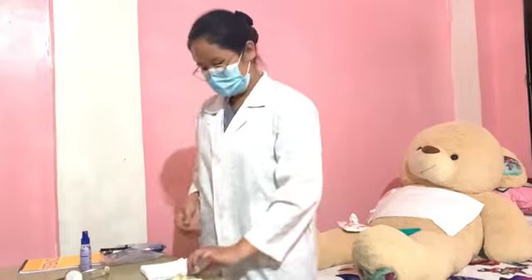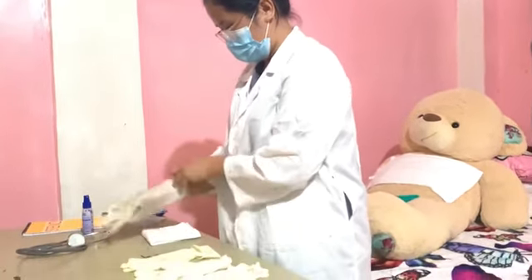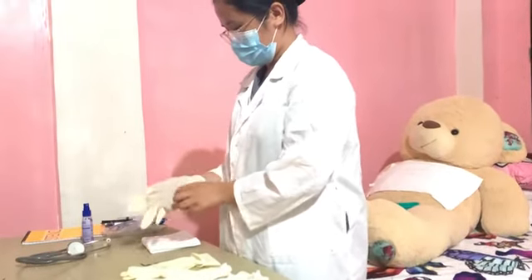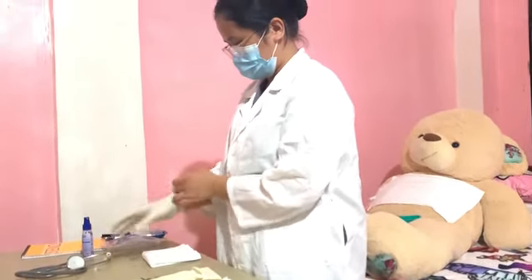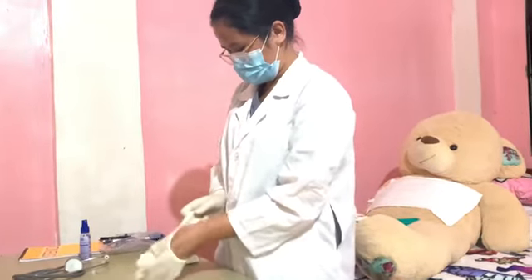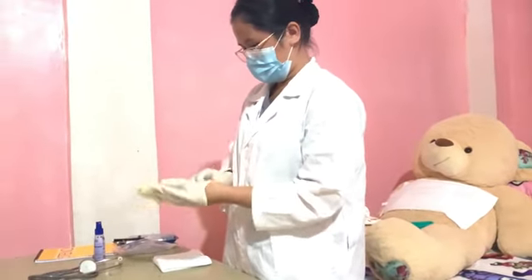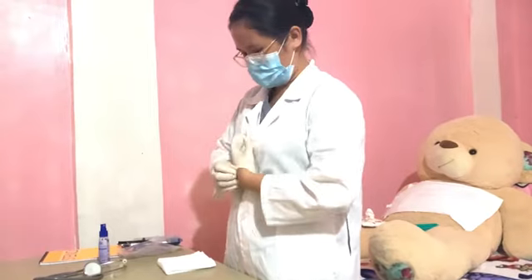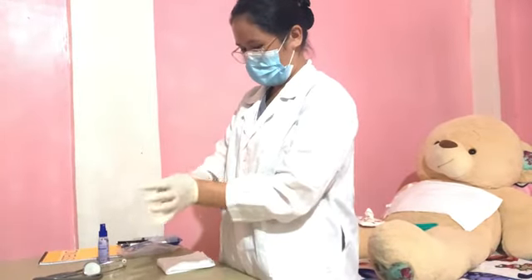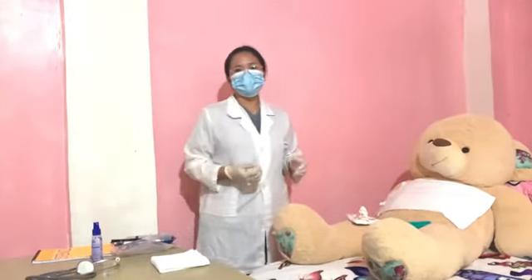And then put on gloves. By putting on the gloves, you can protect both you and your patient from each other.